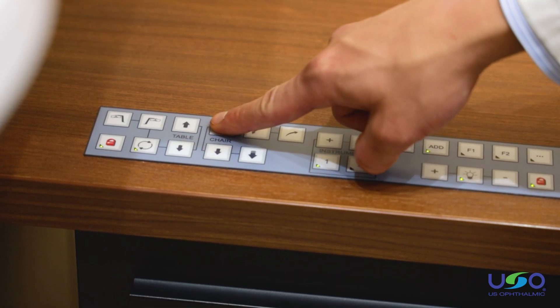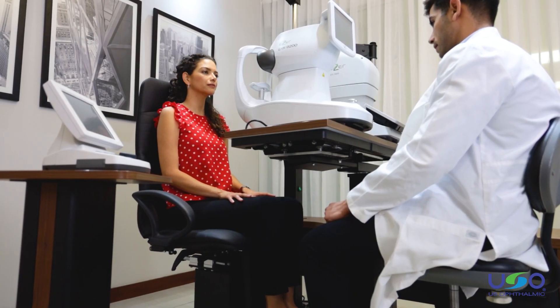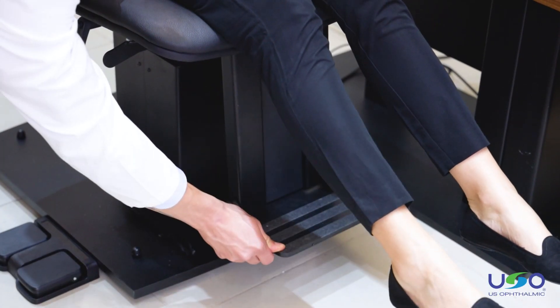The seat is designed to be fully adjustable. By pressing the keypad, the doctor can lift and lower the chair, slide it forward and back, rotate the angle, and recline. The armrests and footrest positions can be modified or completely removed.